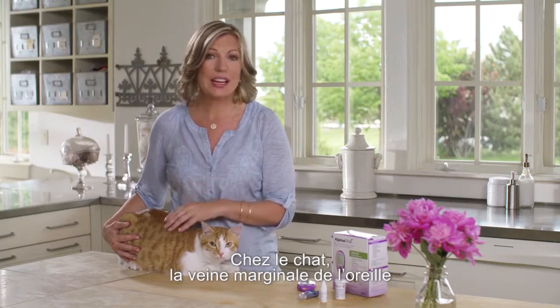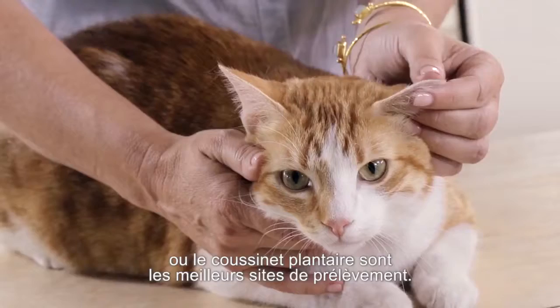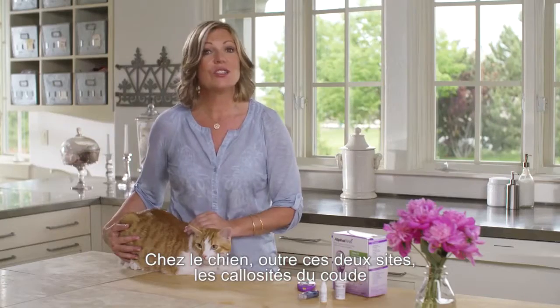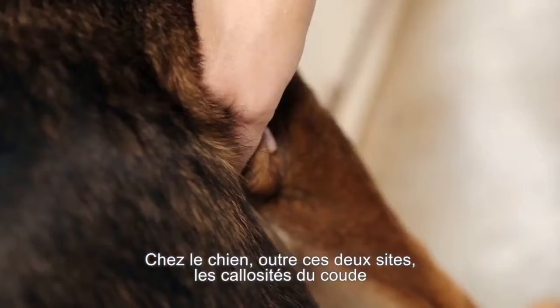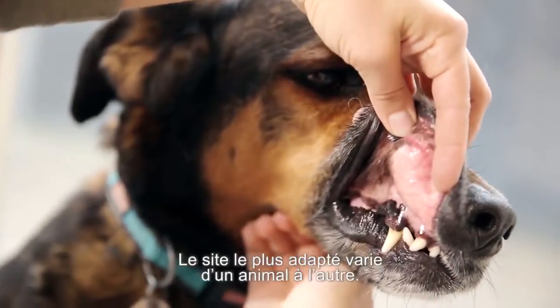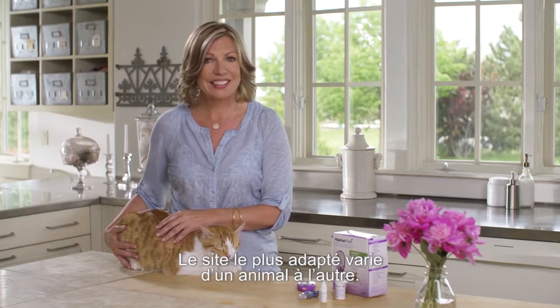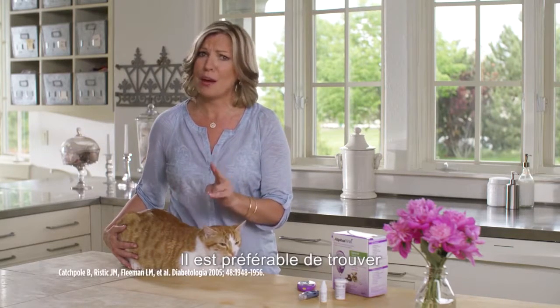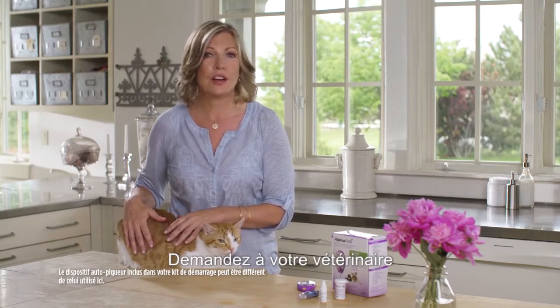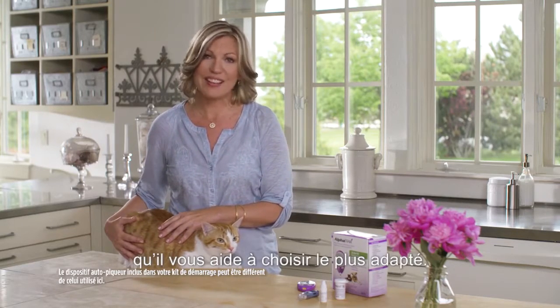On cats, the best site to obtain a capillary blood sample is in the marginal ear vein or the paw pad. On dogs, in addition to the marginal ear vein and the paw pad, the elbow callus or the inner lip also works well. The best site depends on each individual pet. It helps to find at least two capillary sampling sites that work well for your pet. Ask your veterinarian to help select the site that works best.